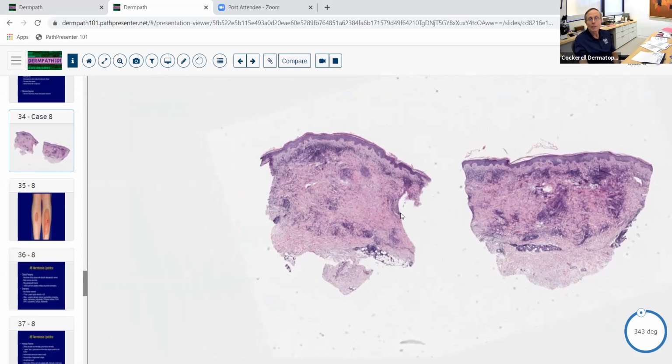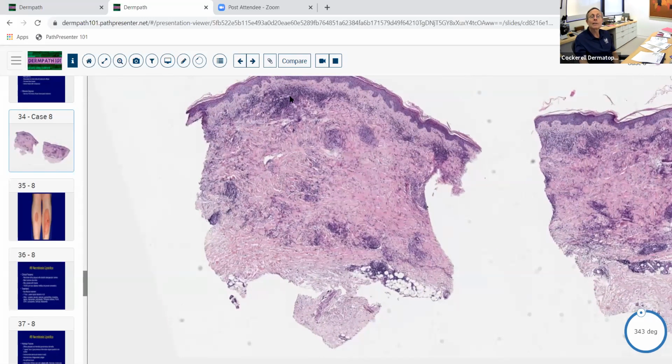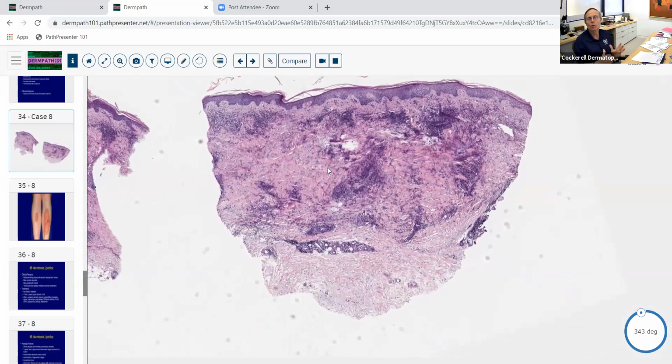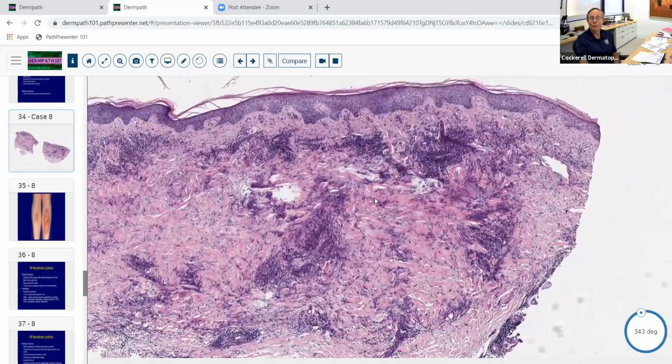We've got a diffuse dermatitis once again. And here, we've got nodular areas of lymphocytes, we've got areas of histiocytes, and they're almost kind of forming a little ring. And they're also going down deep. So we've got a diffuse dermatitis that's almost layered, and it's forming these round little zones. And when we think of that, we think of the palisaded granulomatous dermatitis category. Now, the good news about that is that's a short differential. There's not a lot of things in there, but you have to have criteria to distinguish each of them from one another. Okay, so how do you do that? Well, first of all, what do we mean when we say palisaded? What does that actually mean?